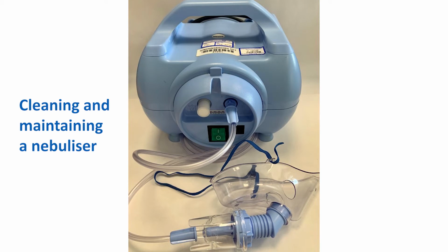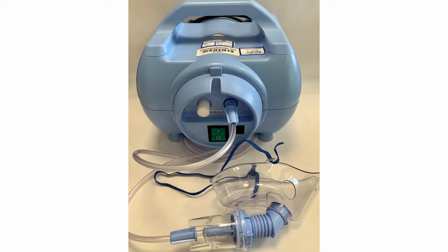Cleaning and maintaining your nebuliser. It is really important that your nebuliser is maintained and kept clean, always following the instructions from the nebuliser manufacturer or healthcare professional who provided you with the machine. If you're using your nebuliser regularly, it needs to be cleaned and dried out thoroughly every day. Once you have finished your nebuliser, it is common for a small amount of solution to remain in the unit. This can crystallise and cause blockage if not cleared through.